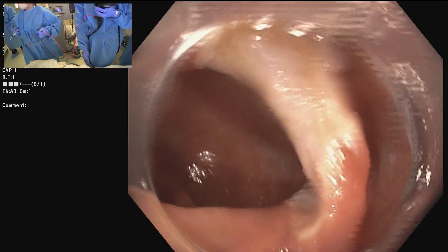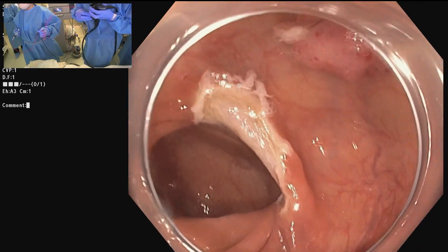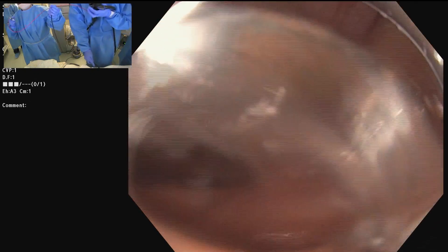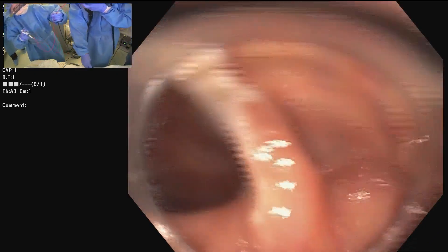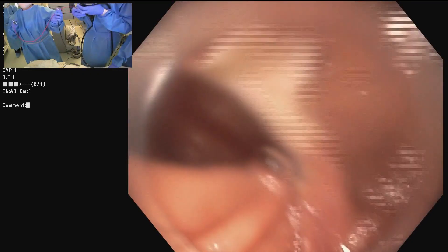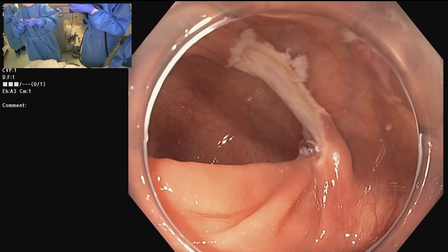What is the purpose of biopsying the margins? It's our protocol. Our endoscopic inspection with near focus underwater is so accurate — I have yet to find a case where I said there's no residual and there was residual. I find this to be very reliable, but it's part of our prospective study protocol.